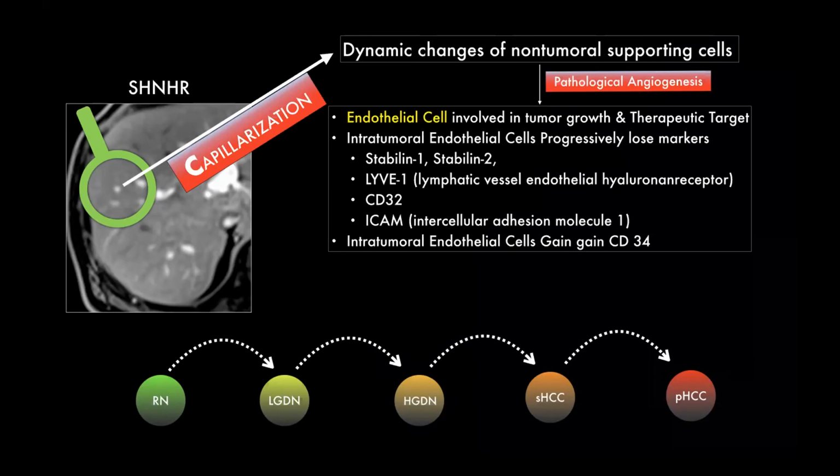But this contrast does not have enough time to reach the arteriocapillary and the capillovenous component. As you have seen on the prior slide, capillarization is absolutely important for change in the milieu of these cells. So for that capillarization, that neovascularity, that neoangiogenesis to be picked up, you don't need to go too early on your contrast phase.